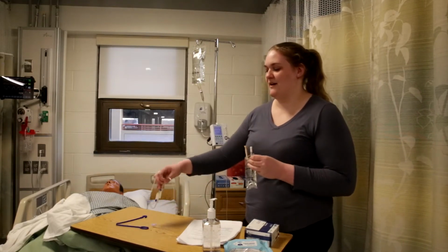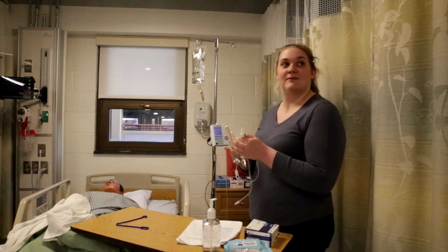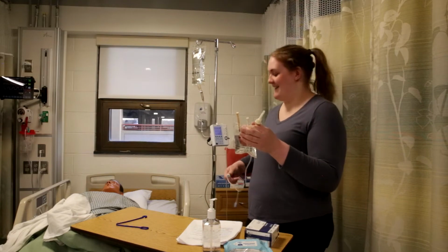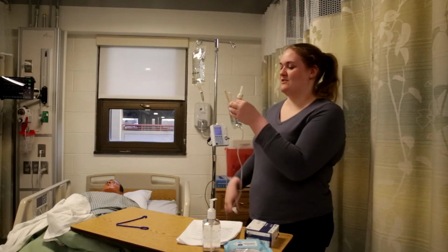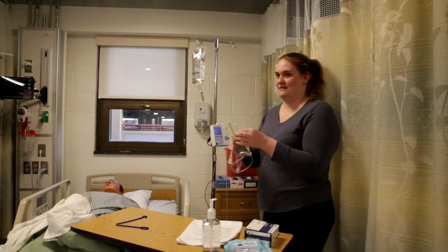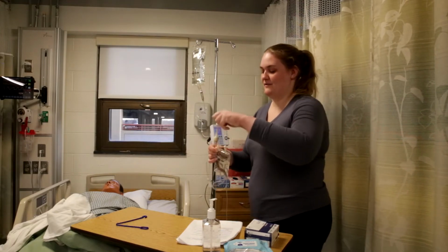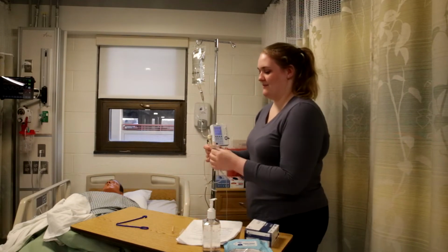So I'm taking this brand new tubing out of the package, and I'm going to clamp it. Then I'm going to make sure that I am keeping everything clean. So I'm going to take this out. That's the blue cap. Take this off. And then I'm going to spike it.